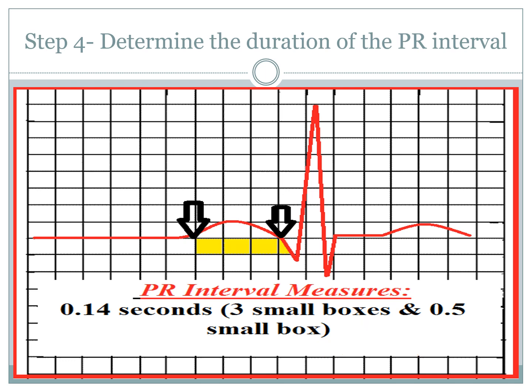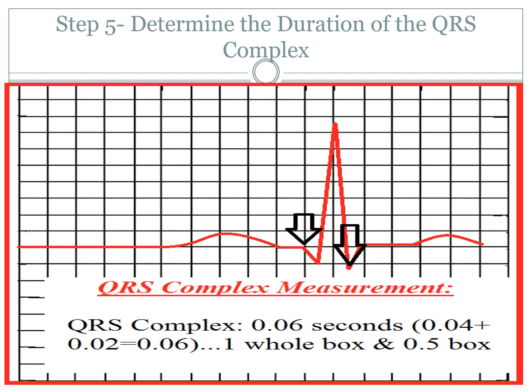Step 5, you need to have a look at the QRS complex. Make sure it's there, and then look at the width of it. See if the QRS comes after every P wave, and is it less than 3 squares? Are the QRS complexes the same size across the board? Do you have a random, large, spread out QRS complex, or is it consistently the same size and shape throughout your ECG? We'll talk more about QRSs when we move into arrhythmias, but right now we're just looking at whether they are present, whether they are the same, and whether they are less than 3 squares.